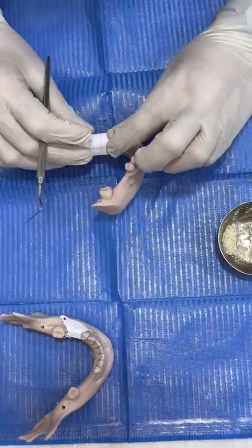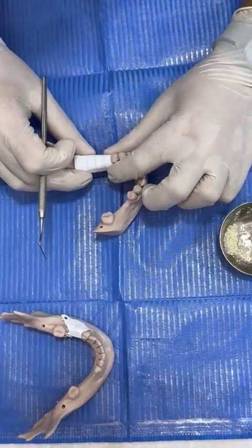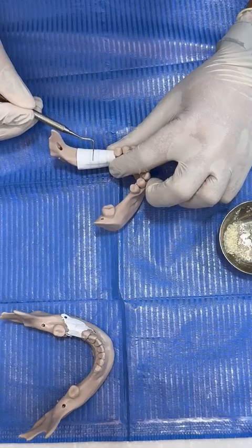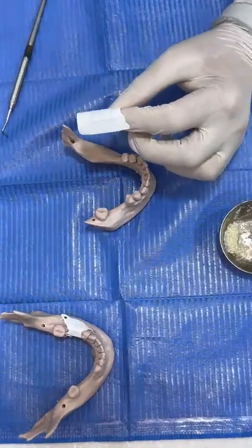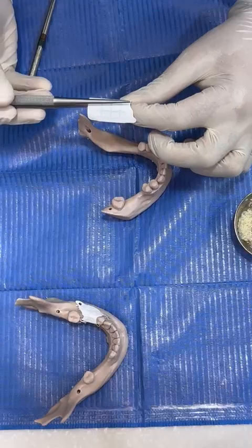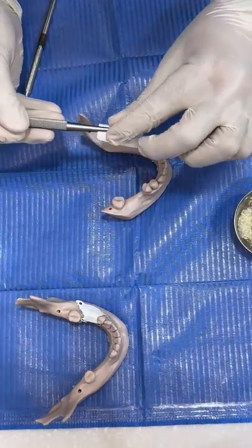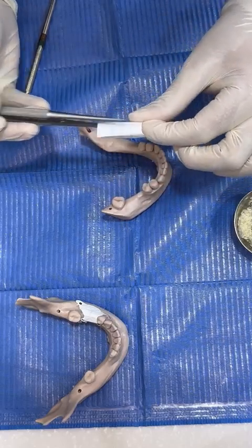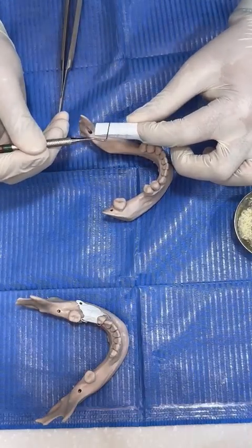Okay, now we can determine the end shape. What is the result we are going to reach? For example, I want to get 10 millimeter here horizontal and 12 millimeter here. So I am going to first use my tissue forceps. I am going to bend the membrane from here like this. I'm shaping the membrane, and I will measure again from my bend. This is 10 millimeter and this is 12.